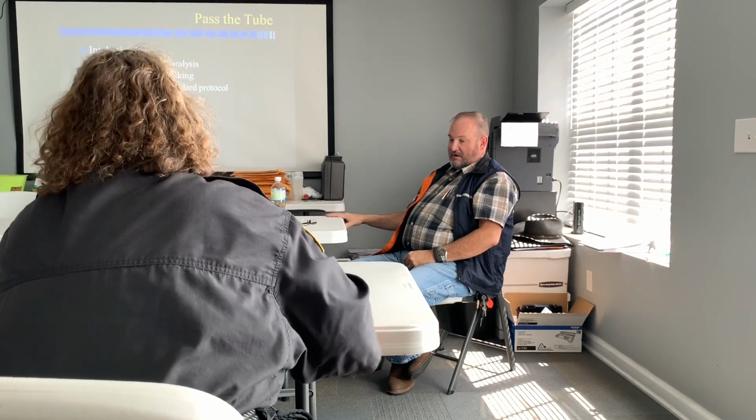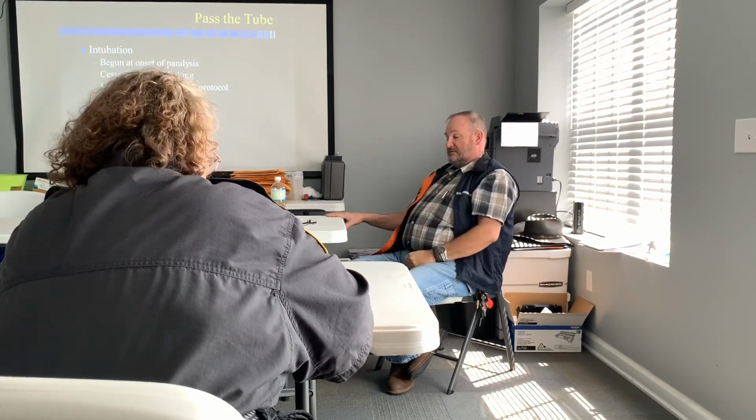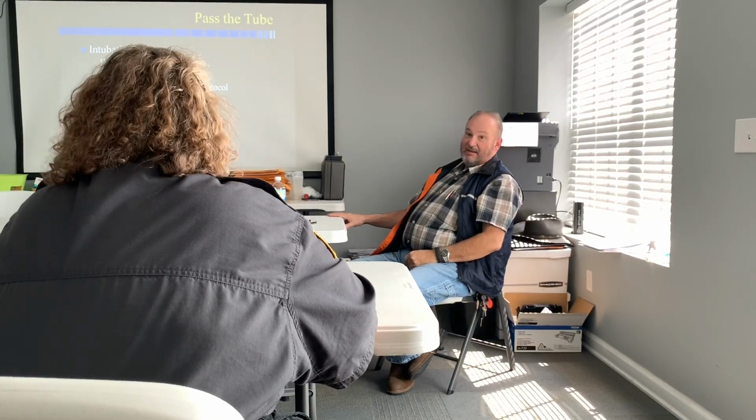We want to limit our attempts to standard protocols. Some protocols will even tell you that you have to have 2 qualified people on scene. You have to have 2 paramedics or 2 qualified people to do this procedure on scene. That kind of limits me, right? Because what happens when, like Warren County, we've got 5 trucks on the road, everybody's got 2 of them out of town and everybody else is on the road and you're up on top of the mountain, right? And you've got somebody who's burned or that needs the MAI procedure and you don't have anybody else. Does that mean I'm limited? I can't use this protocol because I don't have anybody else. If it's written that way, that's what it means, right?